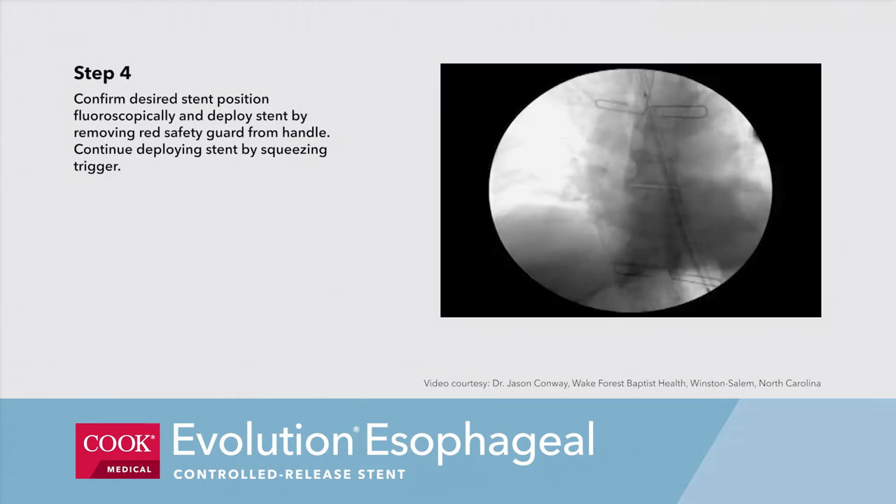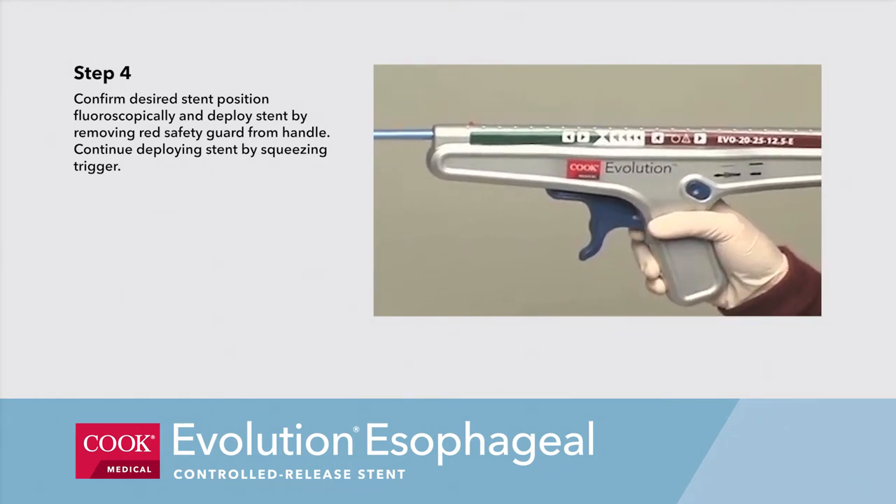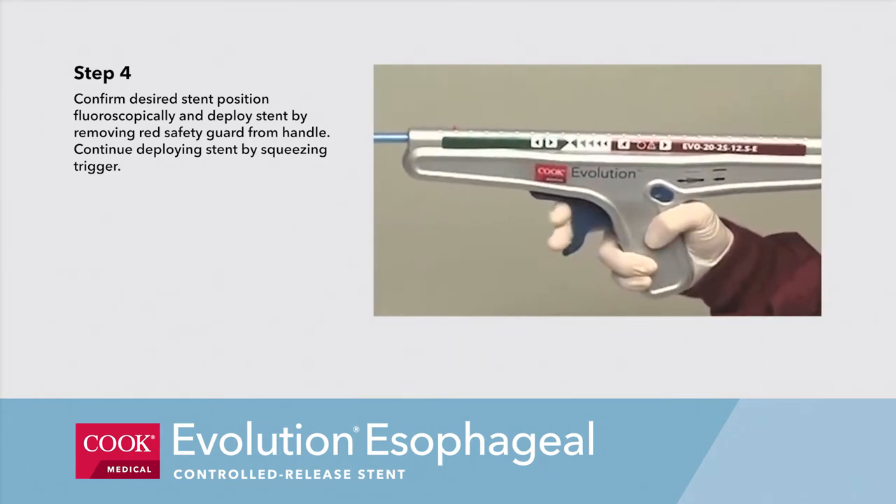Step 4. Confirm desired stent position fluoroscopically and deploy stent by removing the red safety guard from the handle. Continue deploying stent by squeezing the trigger.